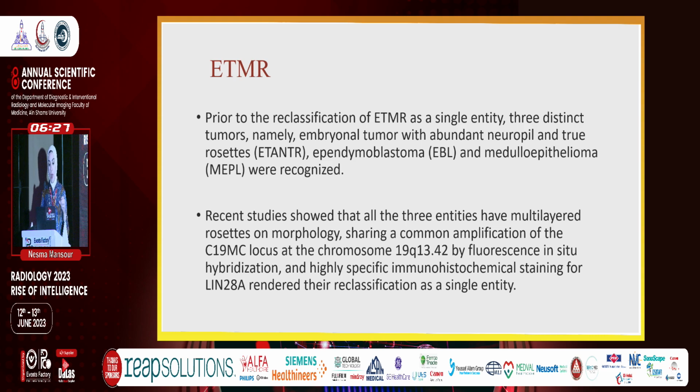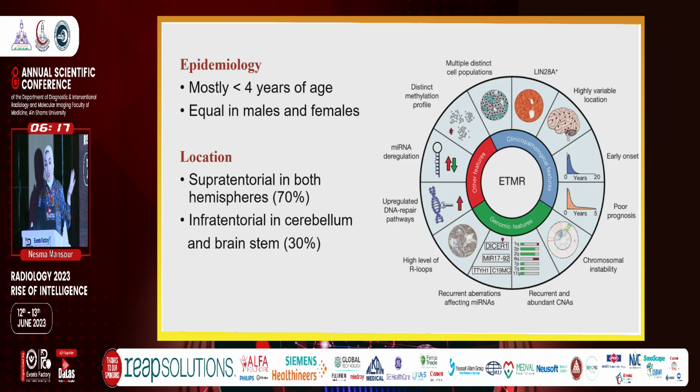They share common amplification of C19MC, as well as highly specific immunohistochemical staining for LIN28, which we have seen in our case. The age group is pediatric, younger than 4 years, with equal predominance in males and females. Location is highly variable, more commonly supratentorial, but it can also be infratentorial.